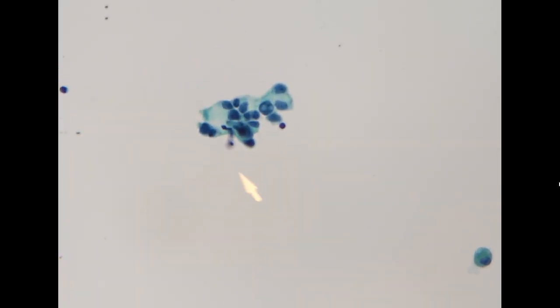So again, if the tumor cell has a cystic change, the most common change is enlargement of the nucleus, and the nucleus will become rounded instead of elongated. So you will see large rounded nuclei, sometimes with pseudo inclusion, and additionally, the cytoplasm will also be more abundant, sometimes with a lot of vacuoles, and looks a little bit like histiocytes.